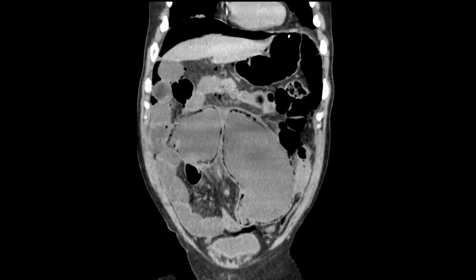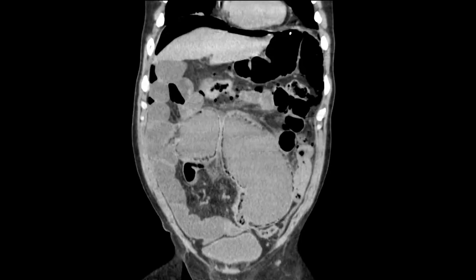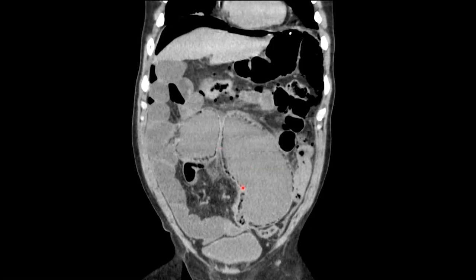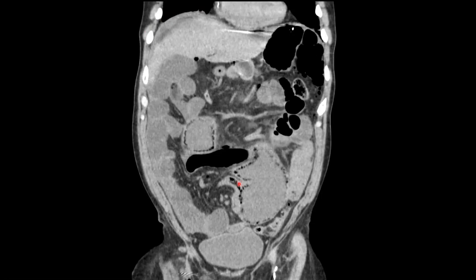When we switch back to soft tissue windows, we see all these foci of gas in a curvilinear distribution — this is actually gas within the wall of the dilated cecum, indicating pneumatosis, which is very suspicious for cecal ischemia. We can see that again as we scroll through. There are also a few foci of free air throughout the mesentery, underlying the liver, and more extensively overlying the liver deep to the diaphragm. Notice that there's this twisting of the mesentery, and that's the site of obstruction causing the cecal volvulus.